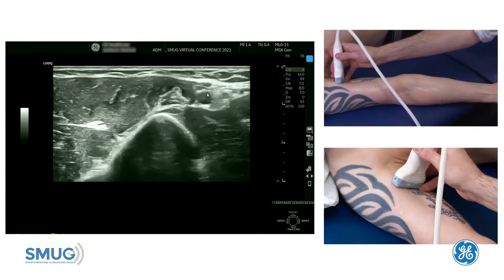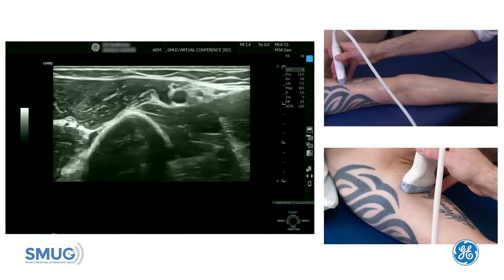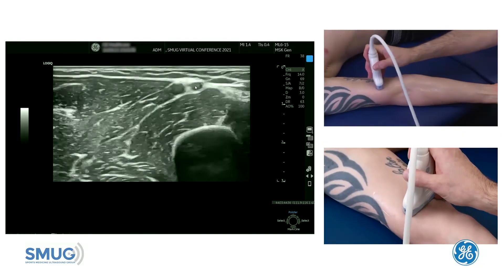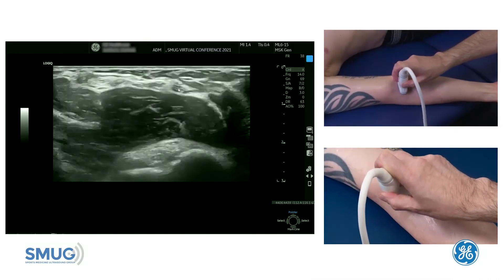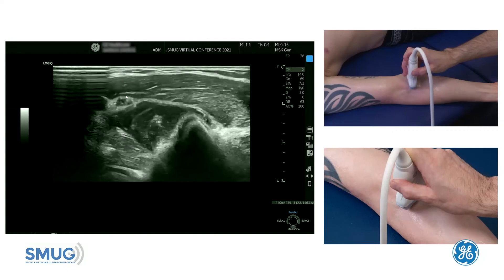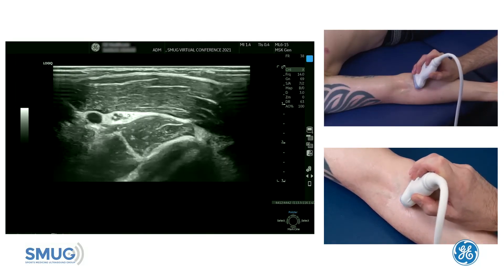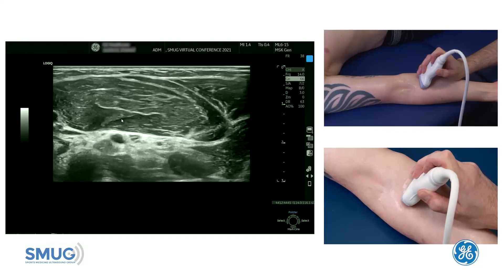We're going to follow the median nerve from proximal to distal, starting quite proximal on the upper arm, identifying it next to the blood vessel. Once you have your eye on it, let's see if we can trace it — there it goes. Slowly follow it down towards the elbow, and there's the level of the biceps on the left side of the picture. As soon as we are here it will start to move into the pronator fascia, and you can work the probe a bit harder to make sure you can see the internal echoes of the nerve and the fascial plane.